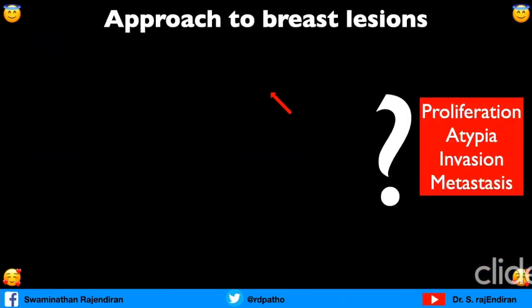So how do we approach breast lesions practically? There are 4 questions you have to ask yourself: whether the lesion is proliferative or non-proliferative, whether the cells are showing atypia or not, whether the cells are coming out of the basement membrane and going into the mesenchyme, which we call invasion, and whether there is any metastasis. So these are the 4 questions you have to ask.